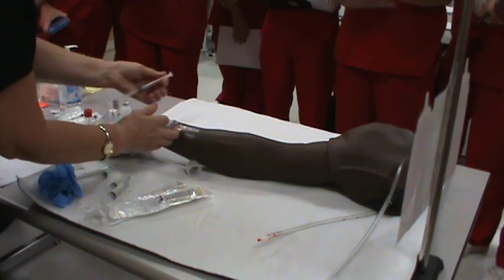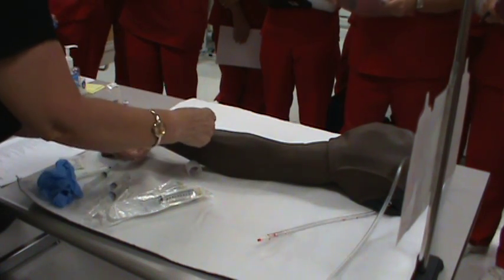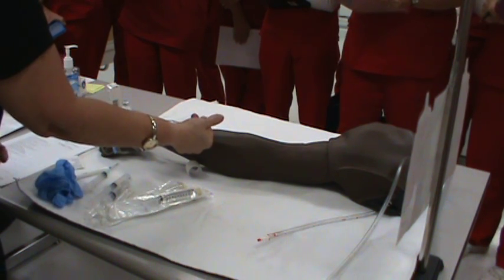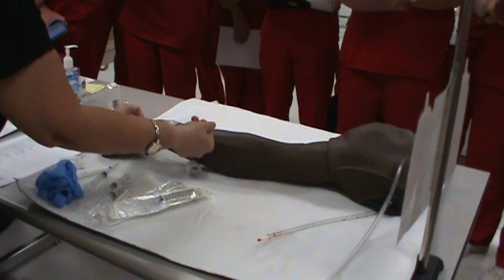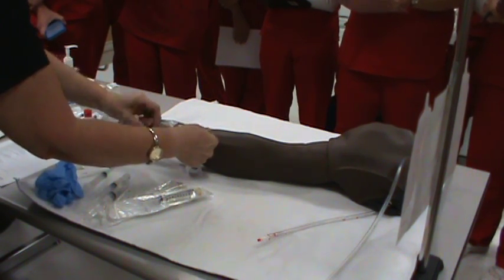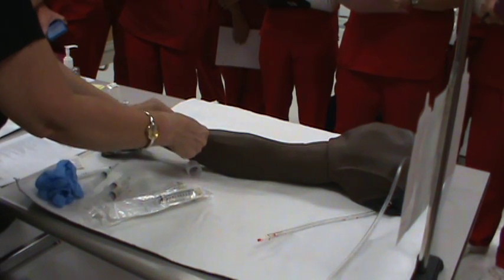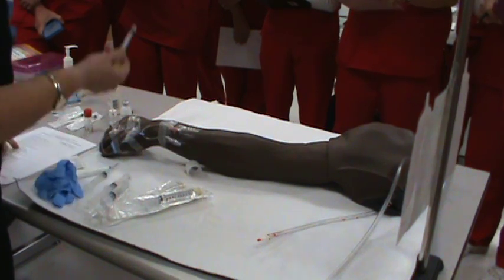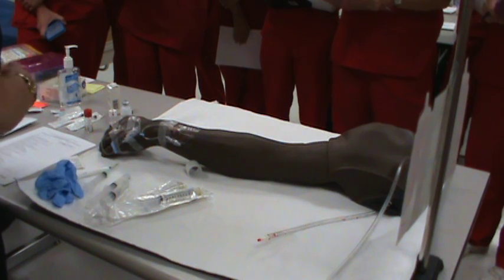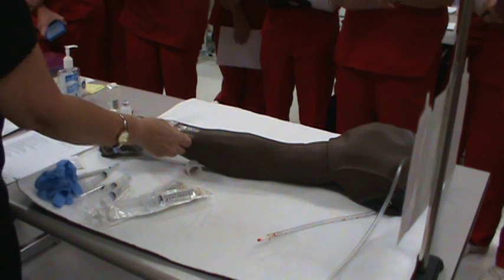So we scrubbed it, attach it, and clamp it. So it's patent. Keep in mind as I'm pressing, flushing it, I'm clamping it, slider clamp, just like that. And remove your saline-filled syringe. Okay, it's compatible. So this is the closest port to the patient.